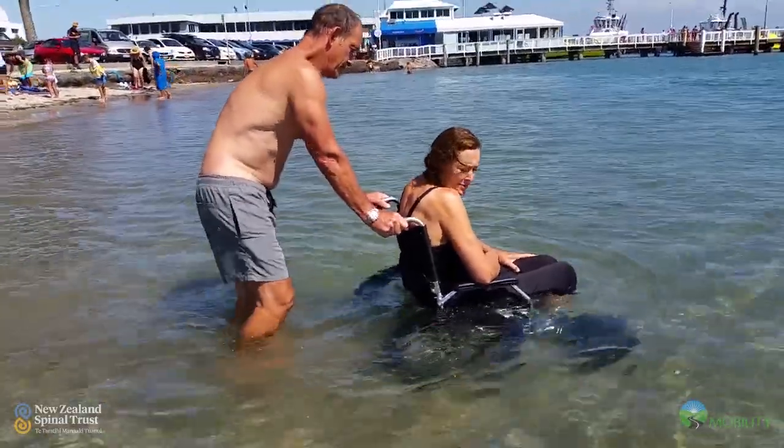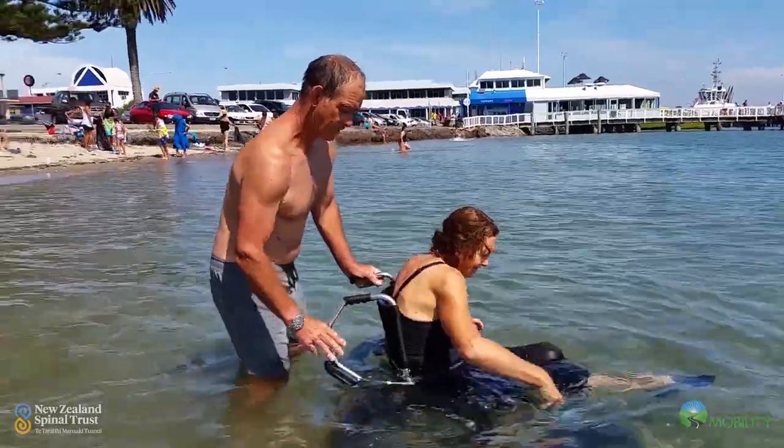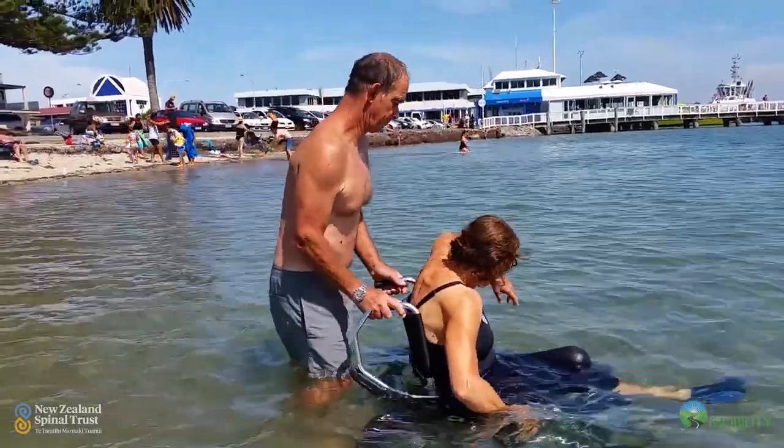And then he took the little front casters and put wheels that could go across the sand quite easily there instead. We tried it out at the beach wondering how it would go and it was just fabulous.